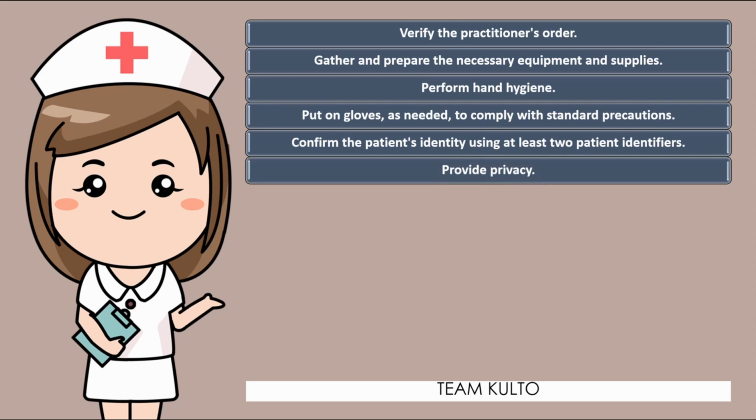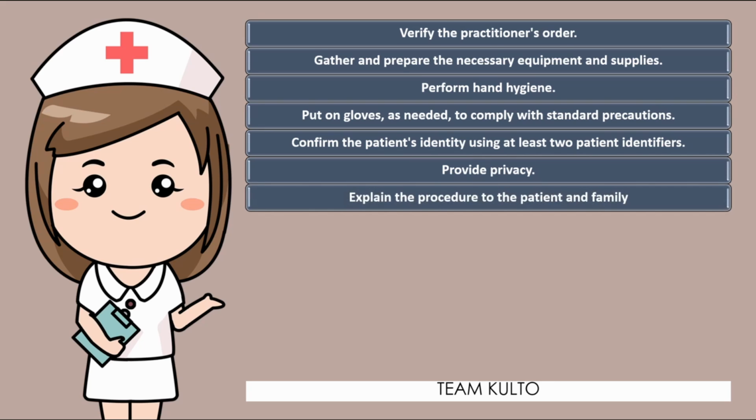All right, provide privacy. Siyempre, provide privacy. You need to make sure that the patient is having privacy kasi i-expose mo yung kanyang chest part. So you don't want to invade the patient's privacy, okay? Next, explain the procedure to the patient and family.